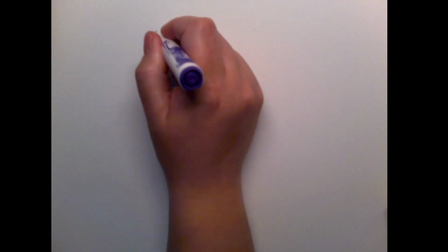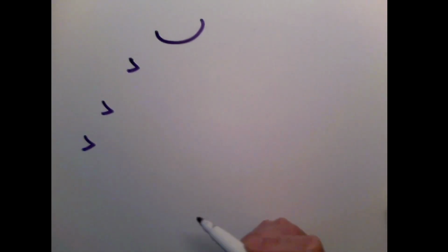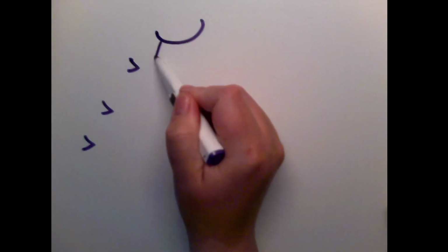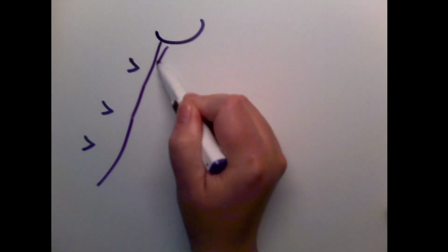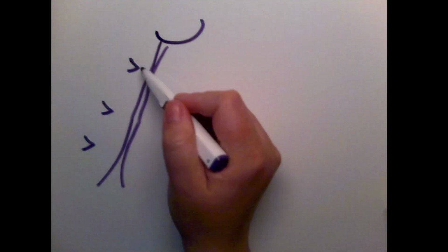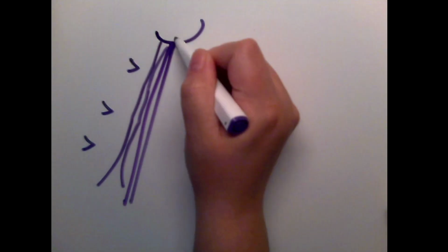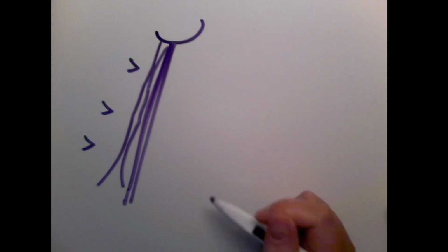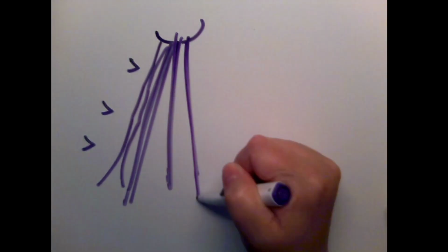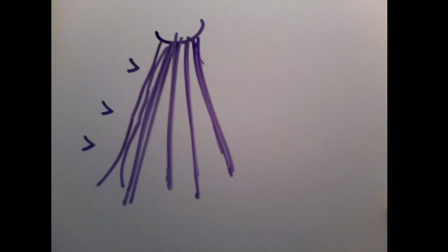So just going back to the whiteboard here, we have our transducer. Say we have 3 focuses on our image. We are going to have a very thin beam that ends up coming out, right? We're going to have those 3 focuses in there. But to make that very thin beam, we've got to send 1, 2, 3 down that scan line. 1, 2, 3 down this. 1, 2, 3. 1, 2, 3 for each one going across.